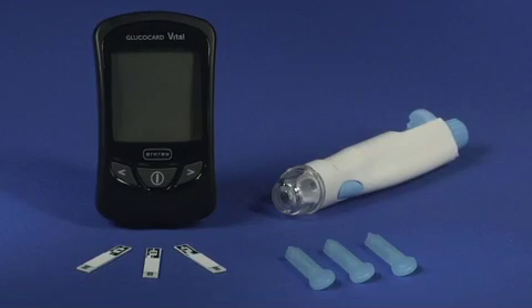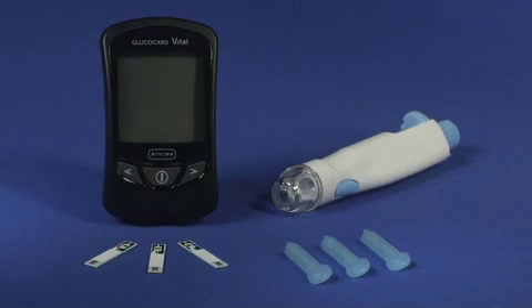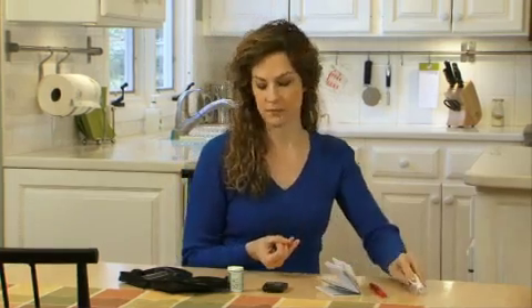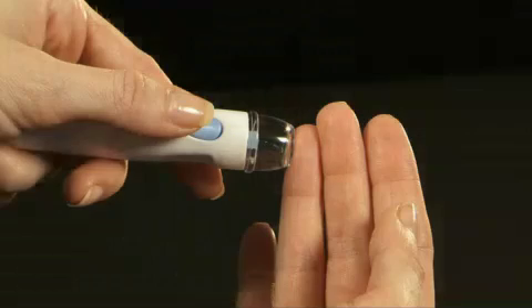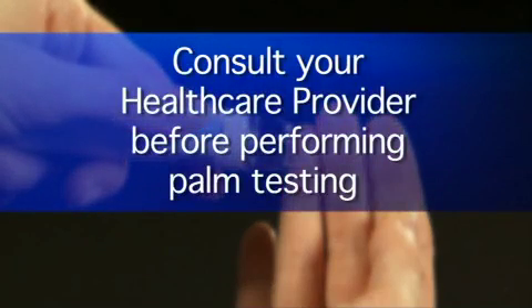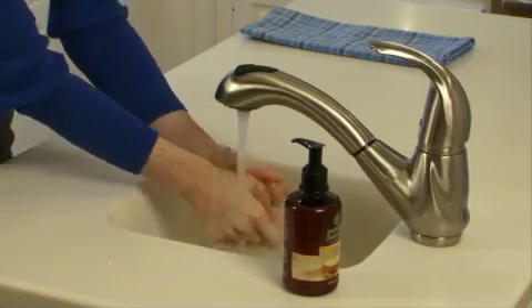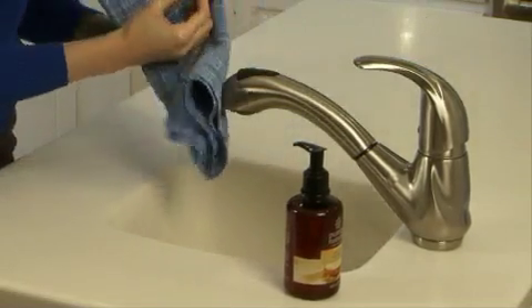To perform a blood glucose test, you will need your Glucocard Vital Meter, Glucocard Vital test strips, lancing device, and lancets. Since the Glucocard Vital System requires a very small blood drop, we will use the fingertip. Speak to your healthcare provider and refer to the user manual before performing palm testing. Your first step before testing your blood is to wash your hands with soap and warm water, then rinse and dry thoroughly.